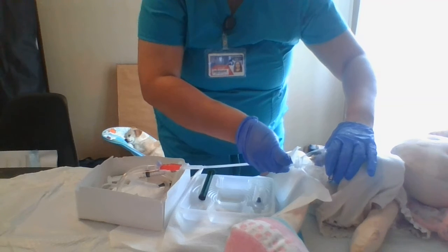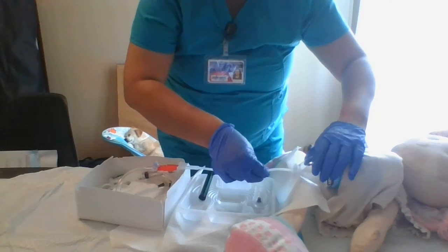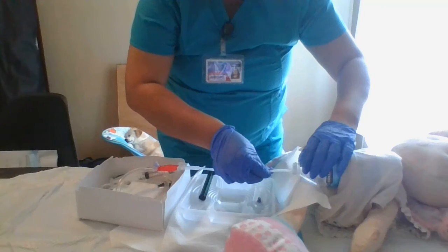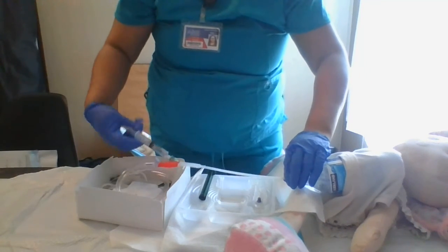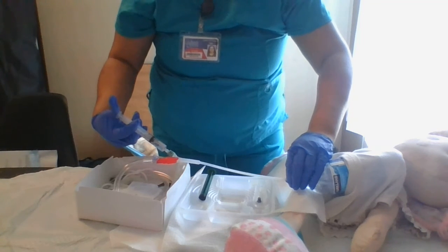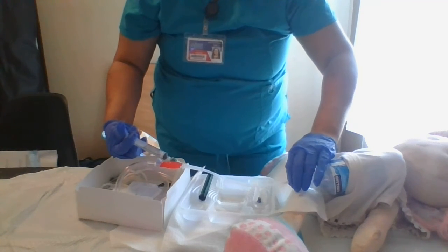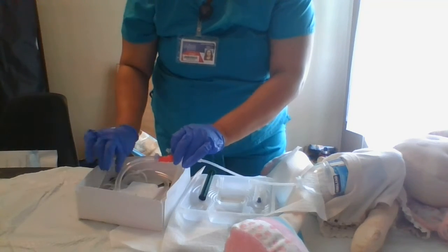Now I'm going to hold the tip with my hand that I have contaminated so that I may fill up the balloon. Holding it in place with my other sterile hand, I am filling up the balloon. The sterile part is now over. I can use this hand to help detach the syringe.